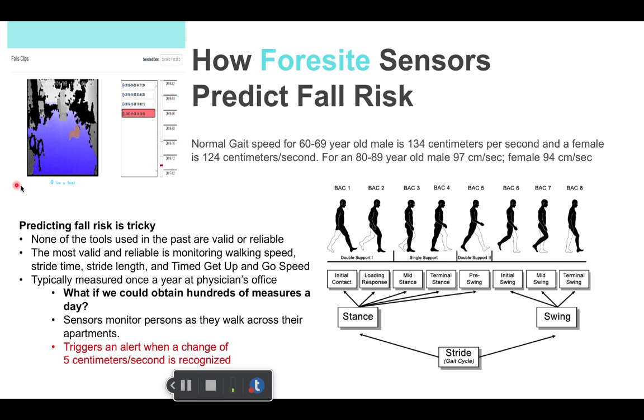The staff will have access to those on the tablet, and then hopefully we can use some of that information to identify how we might prevent those falls in the future, as far as did they trip over something in the room. We saw one individual who climbed up their dresser to reach something and then they fell, some things like that.